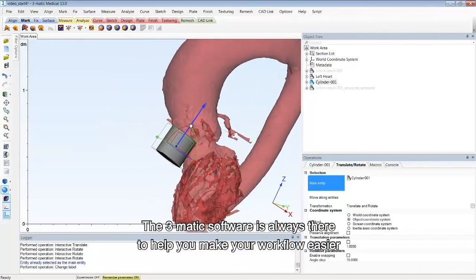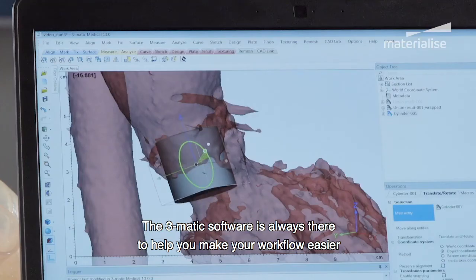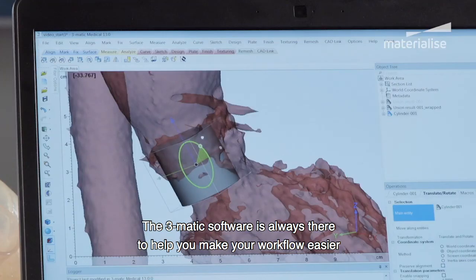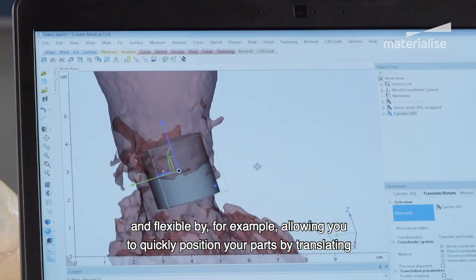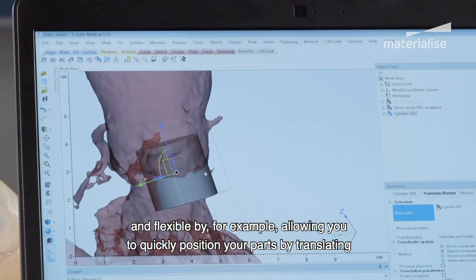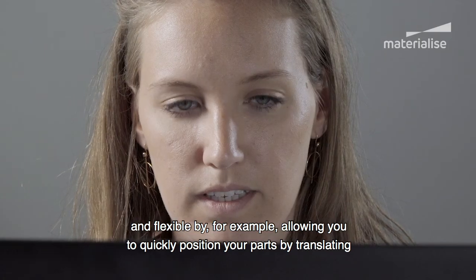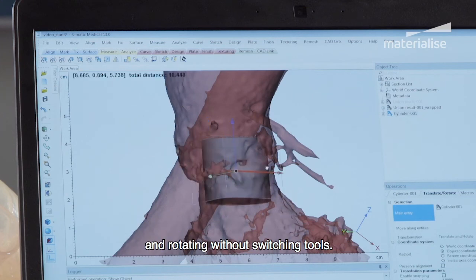The 3-matic software is always there to help you make your workflow easier and flexible, by, for example, allowing you to quickly position your parts by translating and rotating without switching tools.